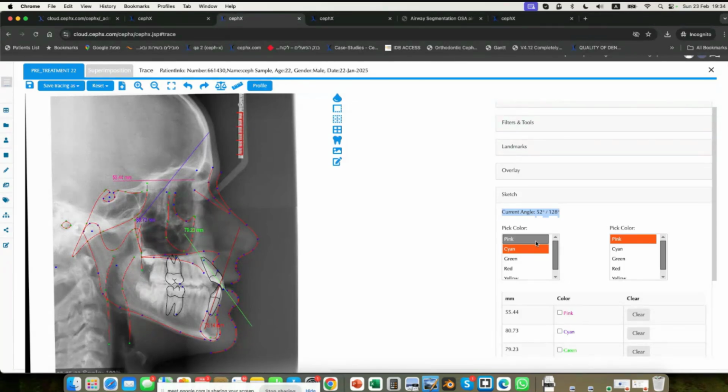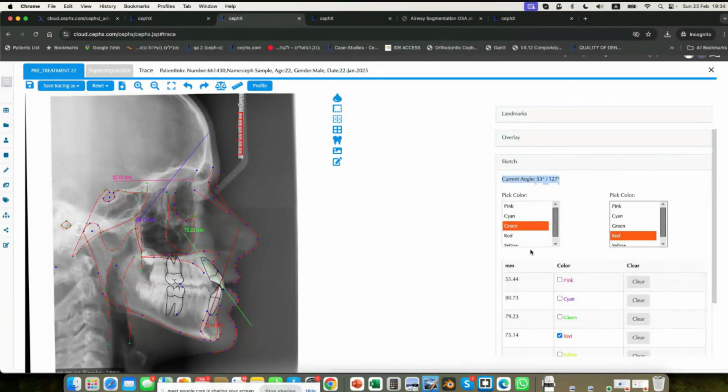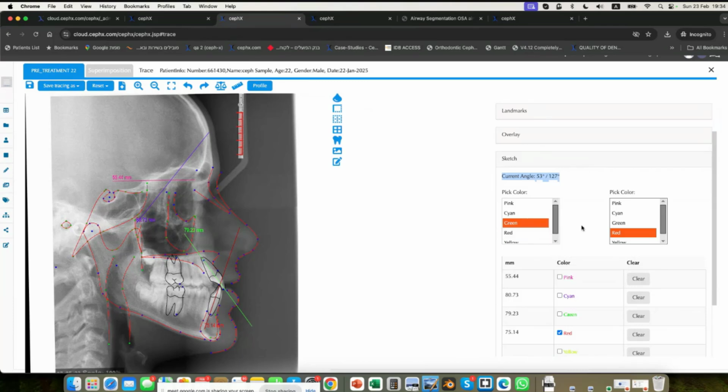I don't remember the exact reading, but the idea is that in our case, it's not that number. Therefore, we're going to have to do procedure A, B, and C. I think that's very helpful in selling the procedure. But with regards to speed, it's pretty much immediate on the 2D side.